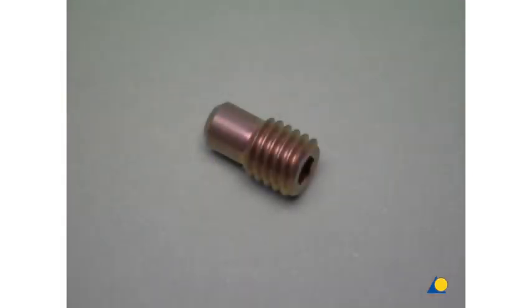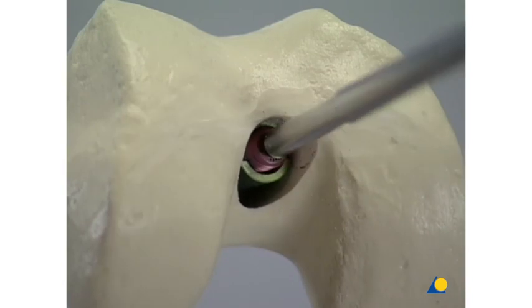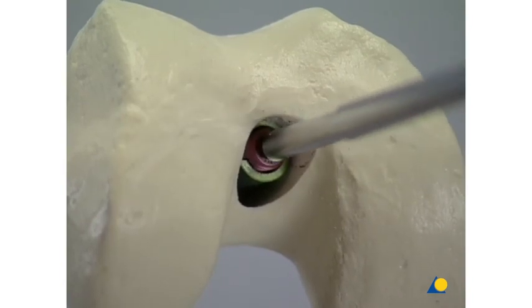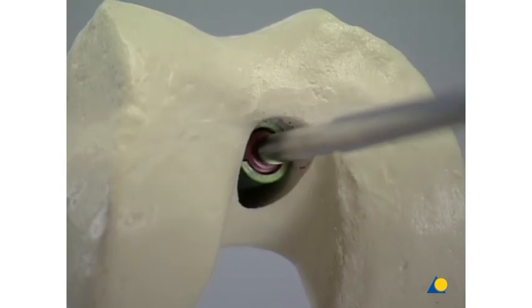Now, the end cap must be inserted. As it fulfills three functions, its use is mandatory. It prevents bone in growth into the nail, locks the spiral blade at a stable angle, and prevents it from loosening. Using the screwdriver, the end cap is aligned with the longitudinal axis of the nail and screwed in tightly.